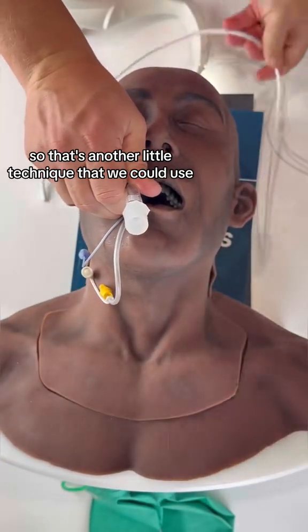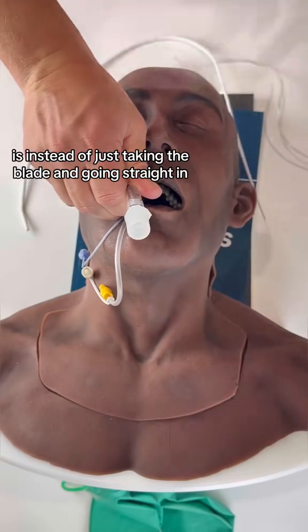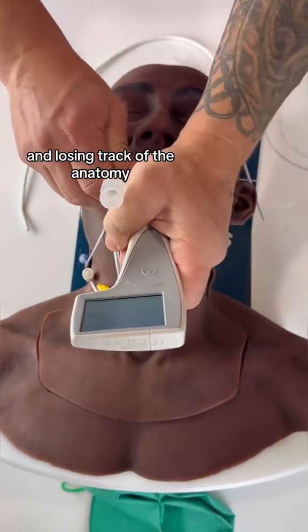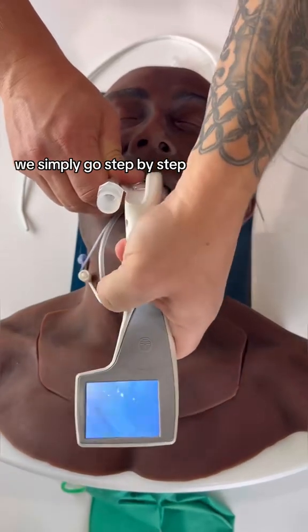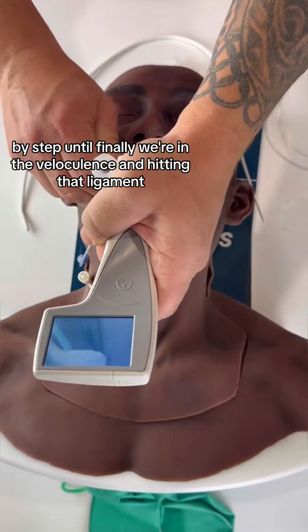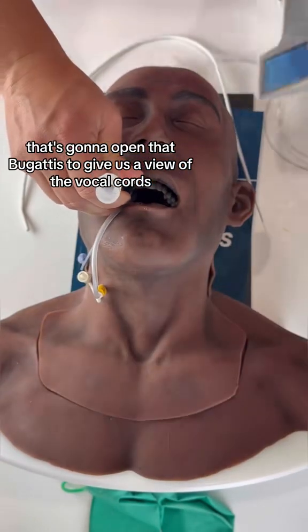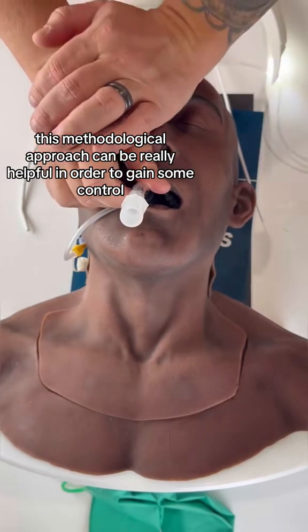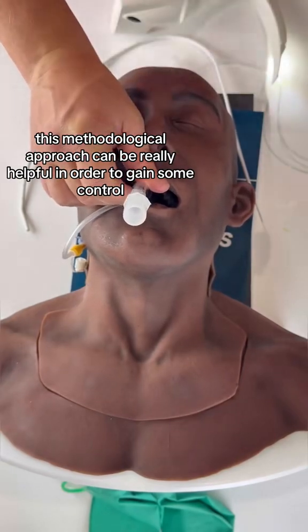So that's the technique: instead of taking the blade and going straight in and losing track of the anatomy, we go step by step until we're in the vallecula and hit that ligament to open the epiglottis, giving us a view of the vocal cords. In a stressful situation, this methodical approach can be really helpful to gain control.